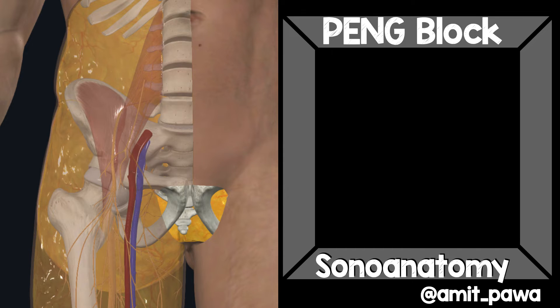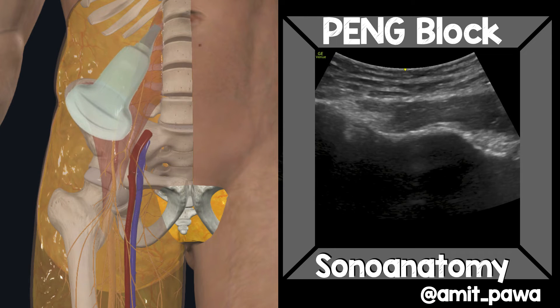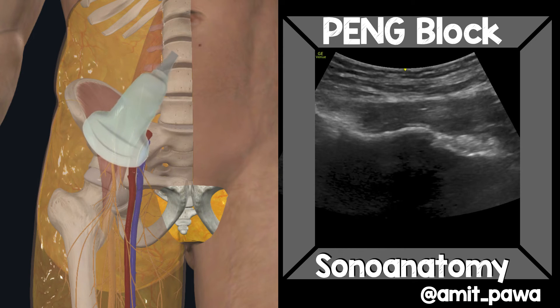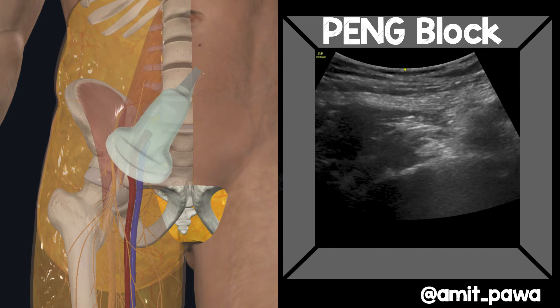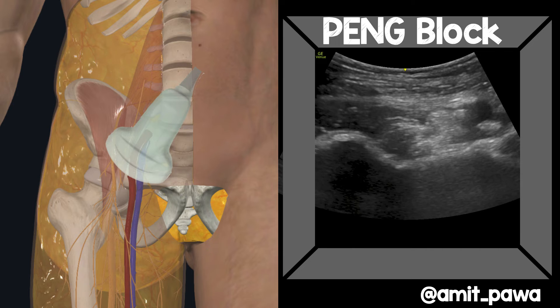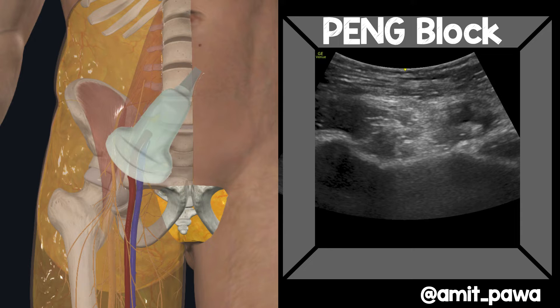To generate an image, place a probe carefully on the anterior superior iliac spine and trace down to the anterior inferior iliac spine, then rotate the probe so it aligns with the pubic ramus. Get the pubic ramus in view while maintaining that little hump of the anterior inferior iliac spine. You can see the femoral artery pulsating, and just lateral to it, lying on the iliacus, is the femoral nerve. Just above the iliopubic eminence, aim to see the bright white hyperechoic psoas tendon. The goal of the PENG block is to lift the psoas tendon up off the iliopubic eminence.